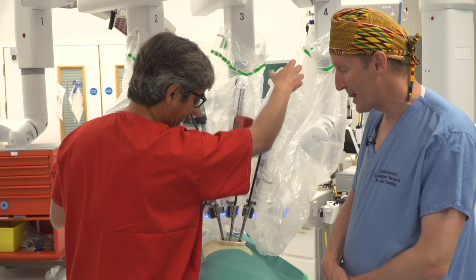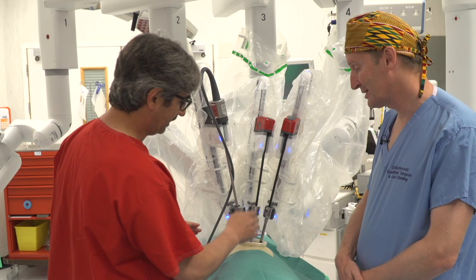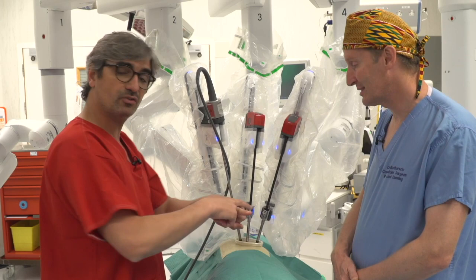So the role of the assistant here is as important as the surgeon at the console. So important. That's it. Well, we always work in parallel. We don't need to cross the hands. It's very important. As you can see, there's no collision at all.